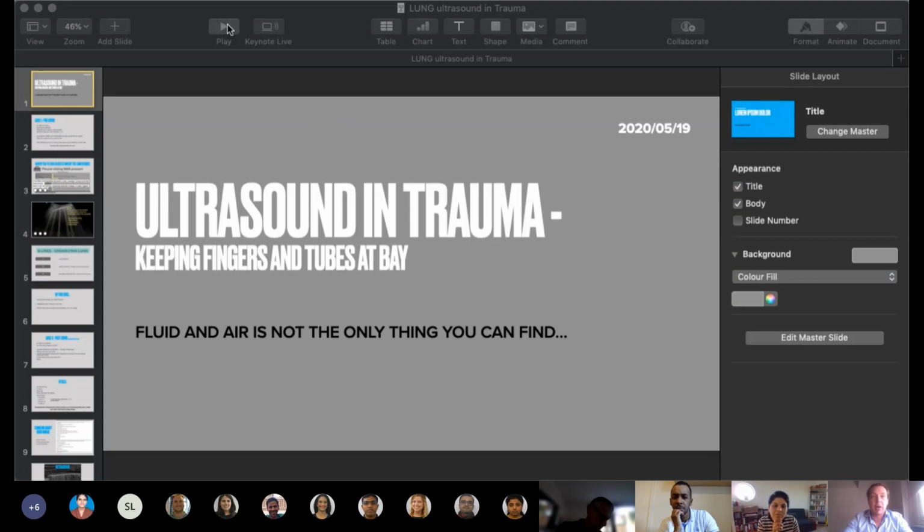And these are some cases where ultrasound was used, and how it was sometimes difficult, and what issues make it more difficult to get to the sensitivity and specificity we want. So the first case is a pre-COVID case, and I'm saying pre-COVID because the area where we saw the patients was in a trauma unit or in ED and JR, and they've got resus beds where it's usually prepared well for accepting a trauma patient.